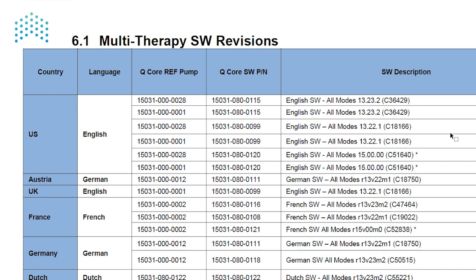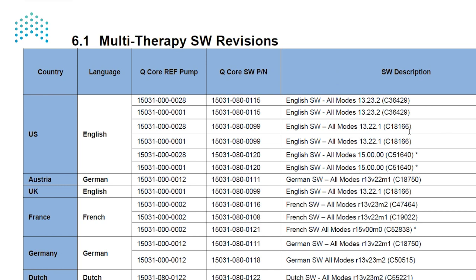For example, say I have a US Multitherapy pump whose reference number ends with 28. We can see here three software revisions which are approved for this pump. Now that we know which software revision can be uploaded to the pump, we can proceed to the uploading process itself.